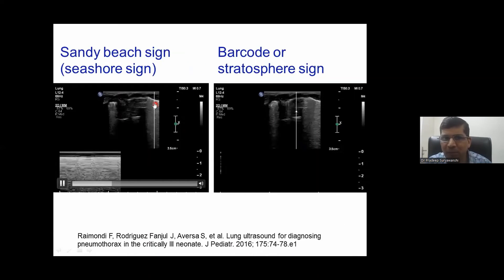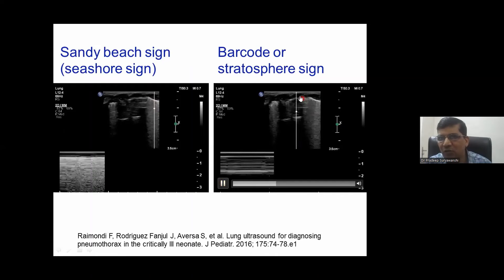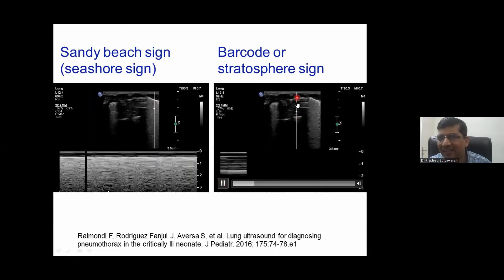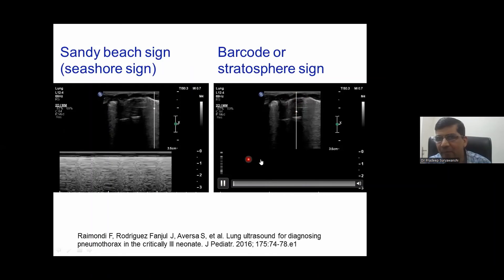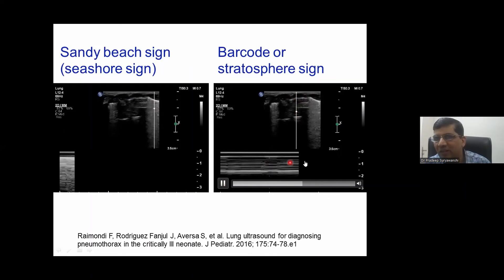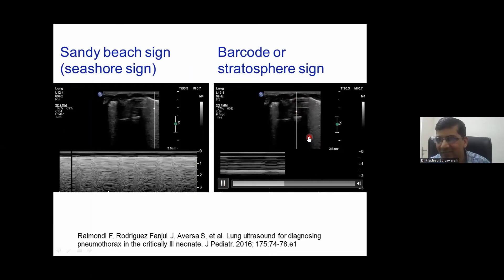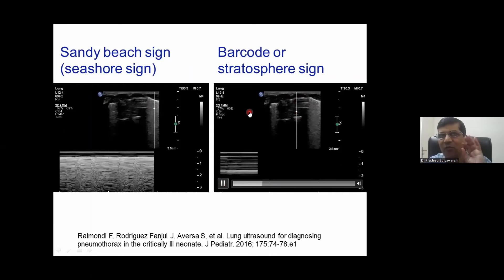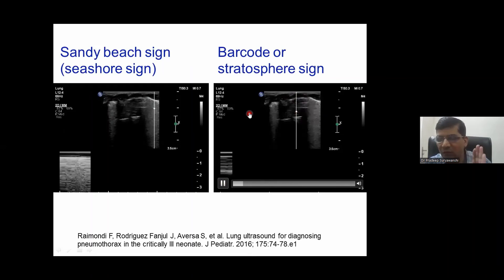The fourth feature: this is the fourth picture. Using M-mode through air — because lung sliding is absent — the M-mode appears like a barcode, and this is called the barcode sign. If you understand this fourth point, we are done with all four features.